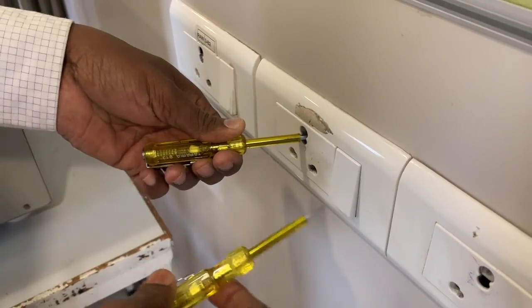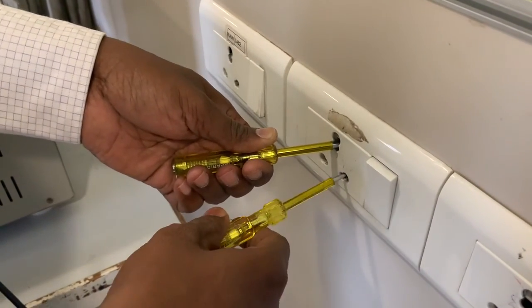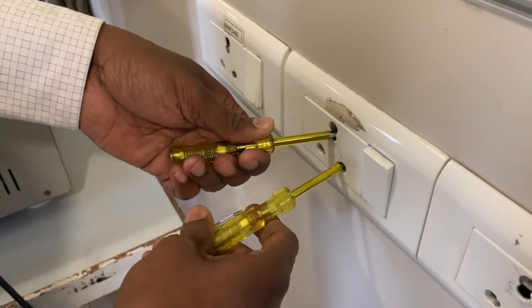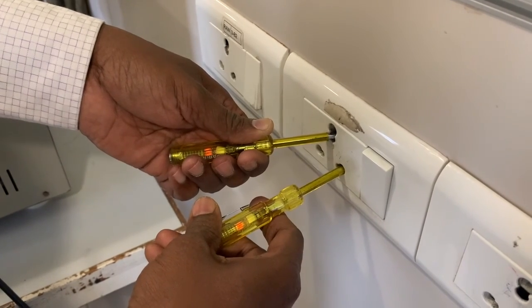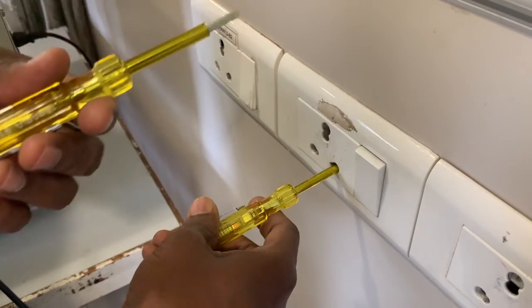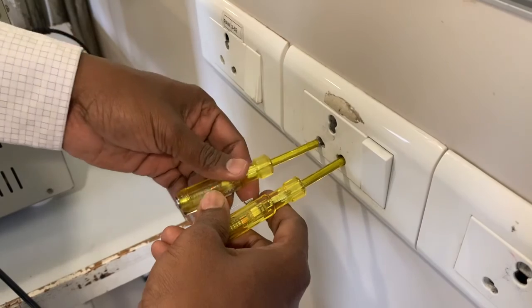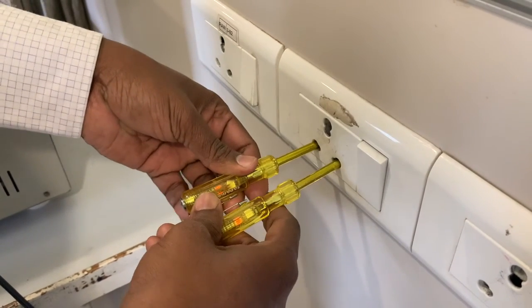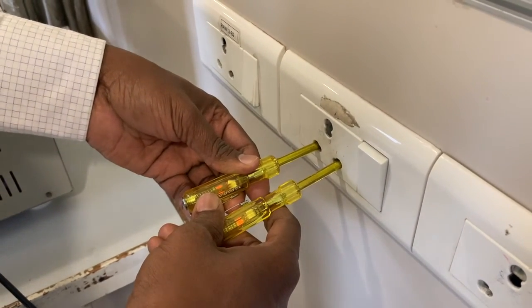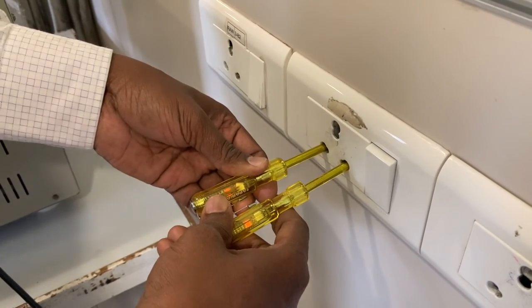Next part is to test it when it is switched on. When you switch on, we expect that the light in the live wire should glow. As you can see, the live wire is glowing. Very similarly, instead of 2 bulbs, I'm using two testers. Now when I insert this tester to the neutral, you see both the bulbs are glowing, which confirms that both live and neutral are working.